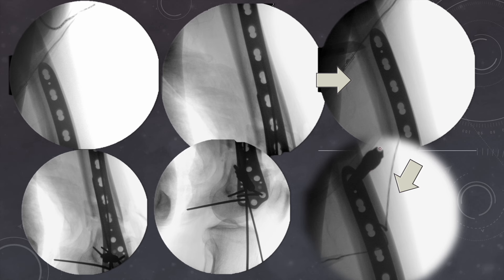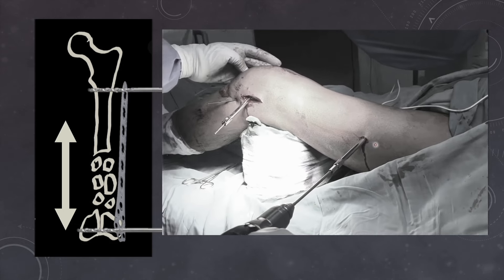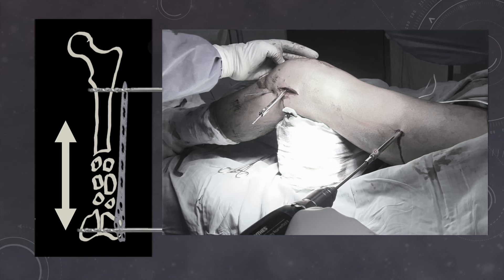Once that has been achieved, we can pass our drill bit through the sleeve — which will be lying in a central location on the proximal segment. We have centralized the plate in the proximal part also, which was anterior in the previous step. Now we are drilling the hole proximally — always get a bicortical purchase with this drill bit. Otherwise there will be some toggling of the plate in inferior or superior direction. If your drill bit ends in the near cortex only, the plate can slide in proximal and distal direction because there will be some toggling. But with bicortical purchase, that toggling will not happen.